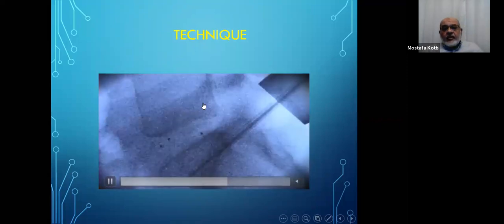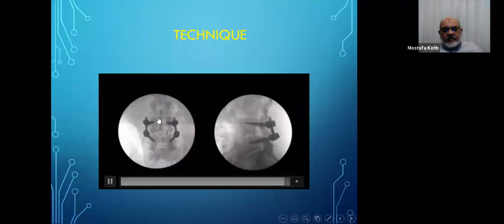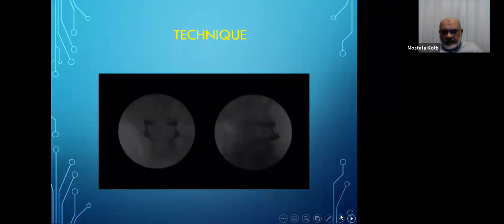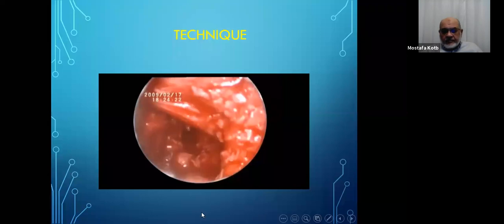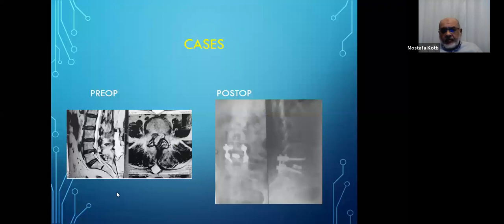And then you do a regular percutaneous pedicular fixation of the same level. And you end up with a decompressed level with four screws and fusion at this level. These are some of my cases, pre and post op.